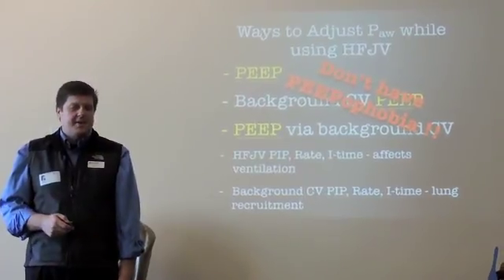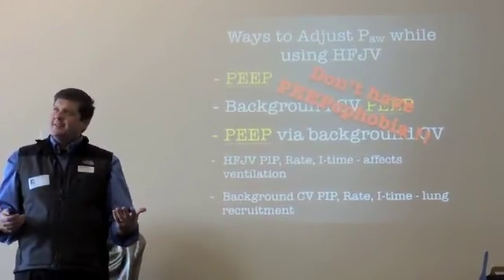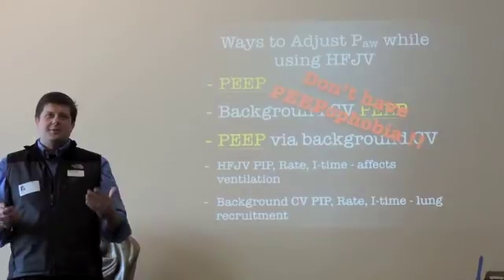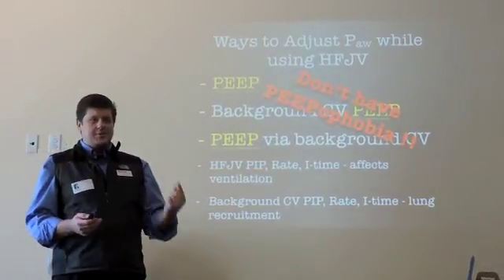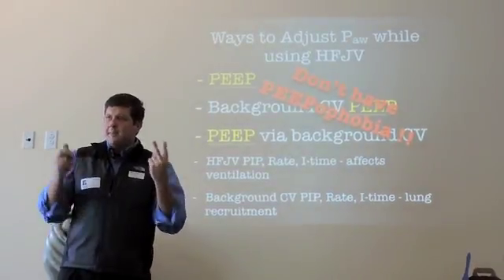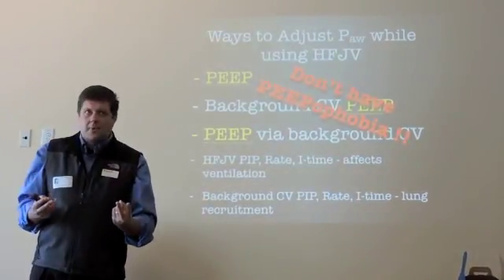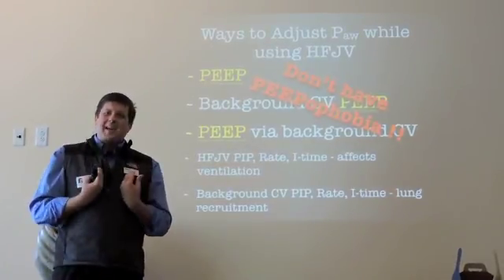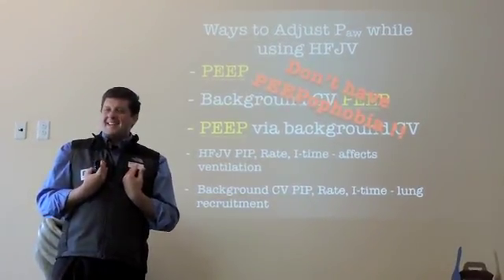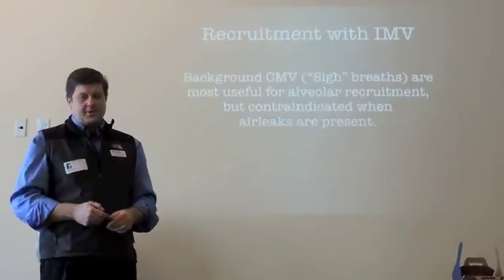So we have it. It's a good thing, and then sometimes it's a bad thing. Don't let it be a bad thing. Get over it. Look at the mean airway pressure. That's what you're after. And then your limit on PEEP is not a number. Your limit on PEEP is blood pressure, okay? When the patient decides that he's had enough, then you've reached your limit there.